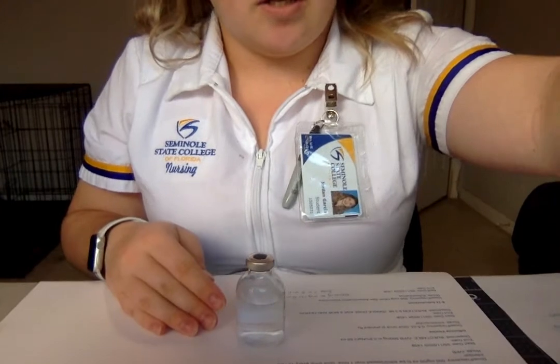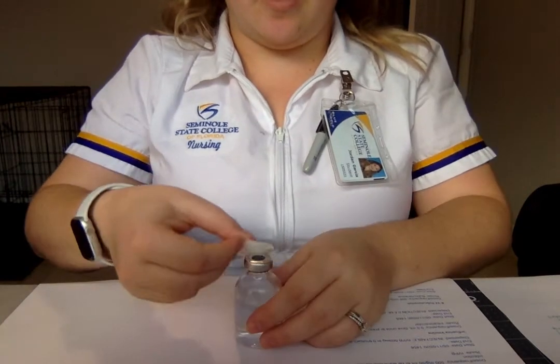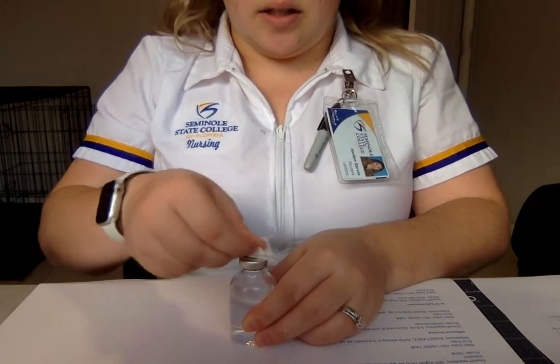So like I said, I'm going to start with my intramuscular one. So I'm going to go ahead and sanitize my hands because I've been touching everything. And then let me point this down so you can see what I'm doing. I am going to take my alcohol swab, and I'm going to cleanse the top of the stopper with this so that it's nice and clean.